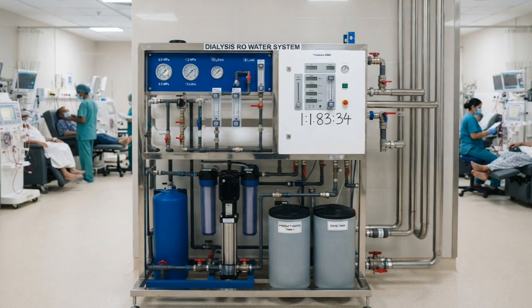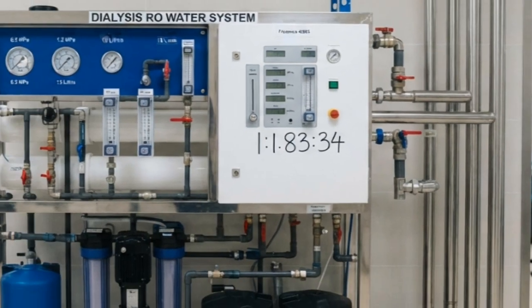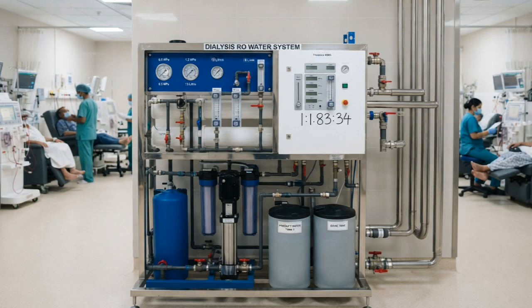Generally, the ratio of dialysate is 1:1.83:34. In that ratio, part A is 1, part B is 1.83 and RO water is 34. So if we take 1 liter of part A, then we have to take 1.83 liters of part B and 34 liters of RO water to make a dialysate for our dialysis treatment.